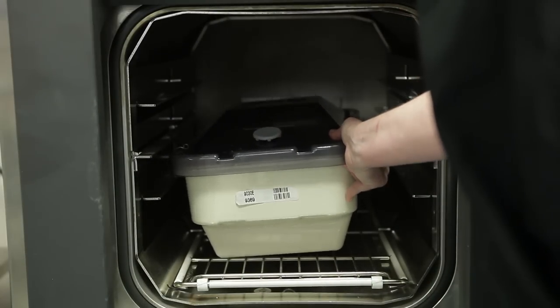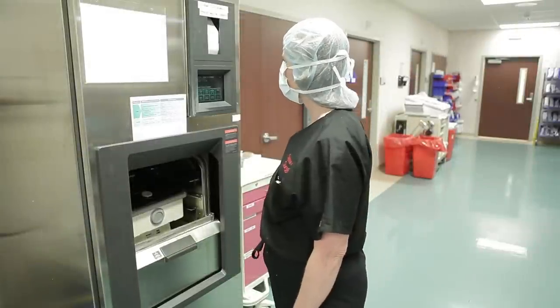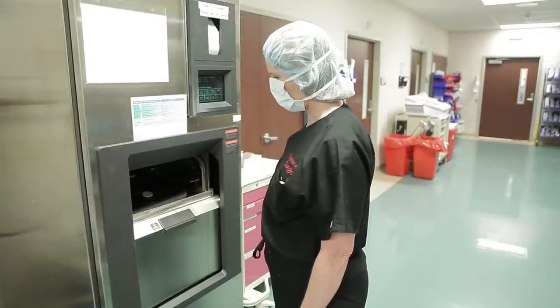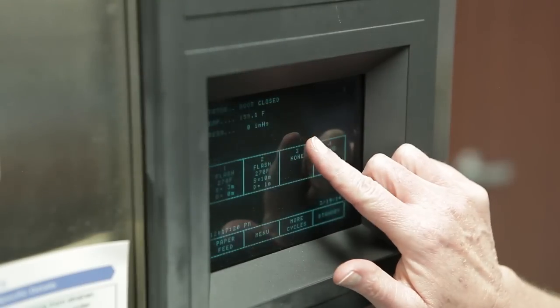Do not stack your FlashPak on top of or under any other container. Place the FlashPak in your sterilizer chamber, ensuring that its feet sit level and flat on the shelf or rack. Select the appropriate sterilization parameters for porous or non-porous loads and for gravity or pre-vacuum sterilizers from the tables in the FlashPak package insert, and start the sterilizer.